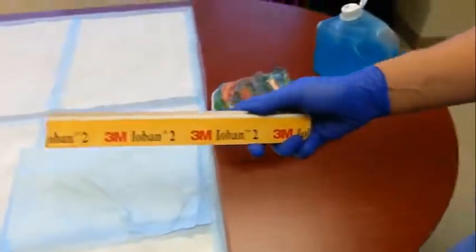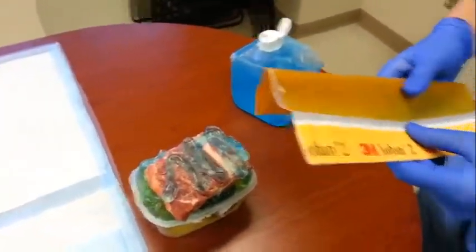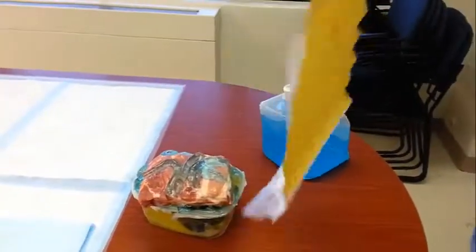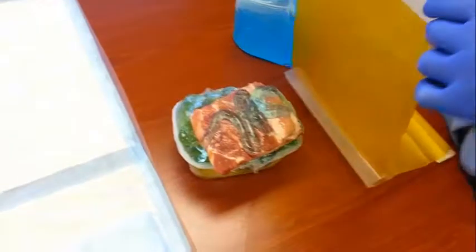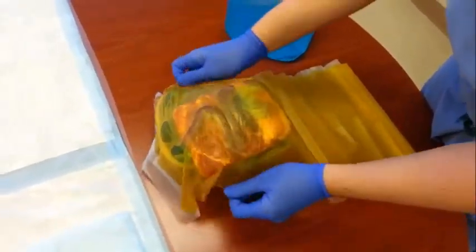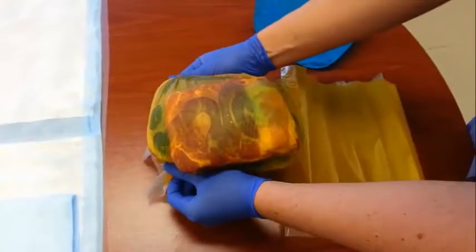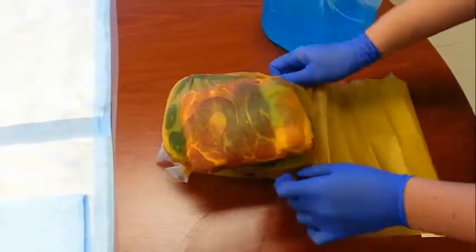Preferred would be Ioban, but you can certainly use press-and-seal or any type of shrink plastic wrap. Once you've got your Ioban stretched out to about the size you need, just drape it over and smooth out all the edges. Once the edges are pressed down, this is actually a little bit more sealed and reliable than press-and-seal.